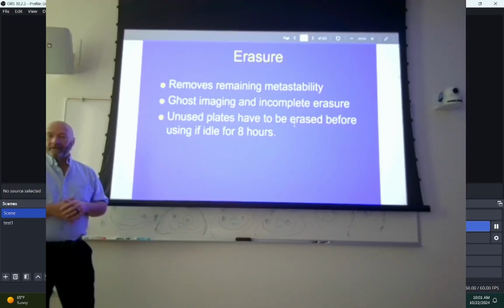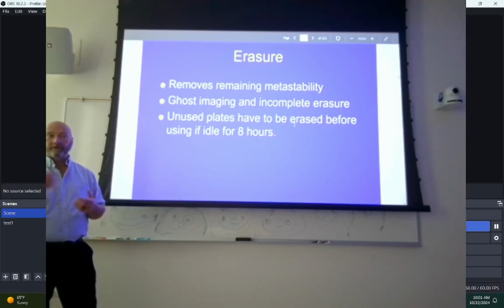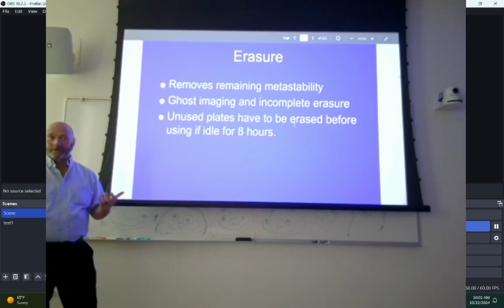Until, like I said, and it was reinforced last year. I think year before last, I think Caleb showed that we can have ghost images on DR systems, and he proved that in our lab. All right, so he took an X-ray of very high exposure with metal, and for a few exposures after that, we'd wind up with the metal. We could see what it was in that image.